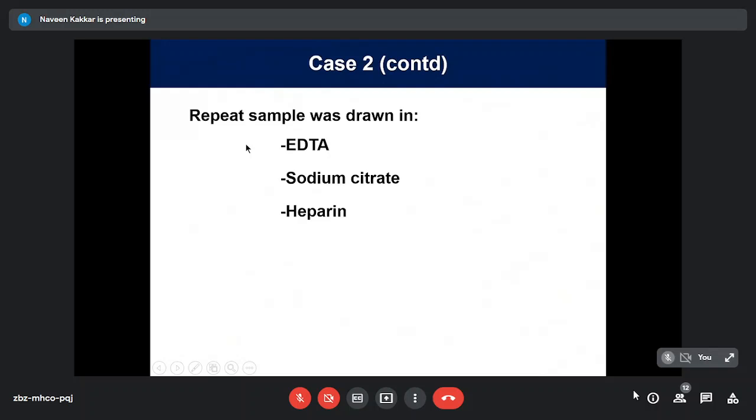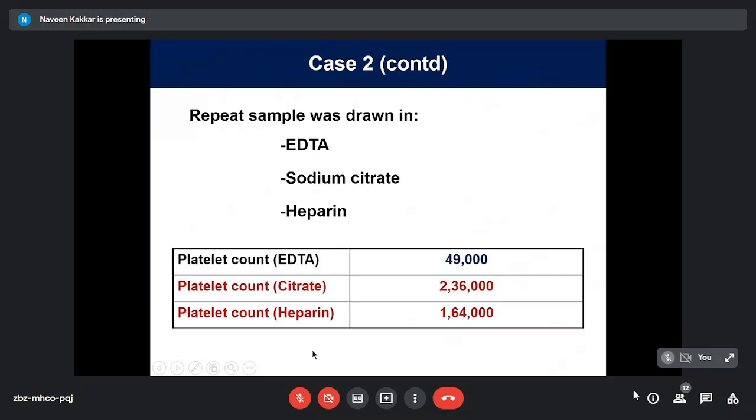So whenever you have a problem with EDTA, you take the help of sodium citrate and heparin. So a repeat sample was done in EDTA again to reconfirm the findings, along with sodium citrate and heparin. This is what we got. Platelet count in EDTA was still low, 49,000 now, but citrate and heparin showed normal counts. We gave the higher count obviously, 236,000, so there was nothing wrong with this patient.